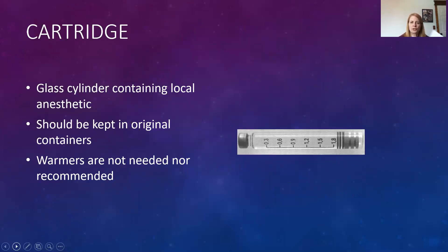The cartridge is a glass cylinder full of local anesthetic drug. On one end is the rubber stopper where the harpoon engages, and on the other end is the diaphragm and aluminum cap, where the needle inserts into the cartridge. Cartridges should always be kept in their original containers. Warmers are not needed or recommended — there used to be a belief that warming anesthetic to body temperature would reduce patient discomfort, but it has been shown to cause burning on injection. So no warmers.